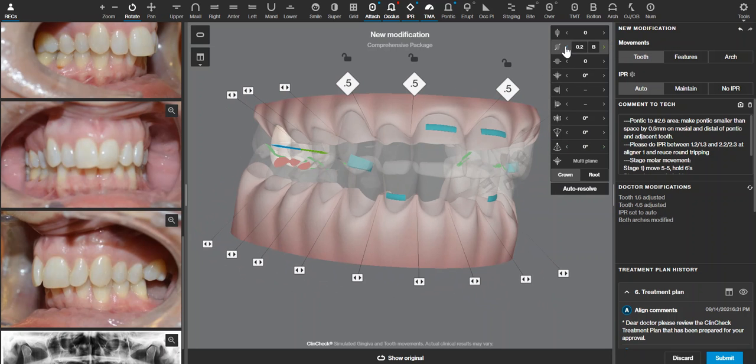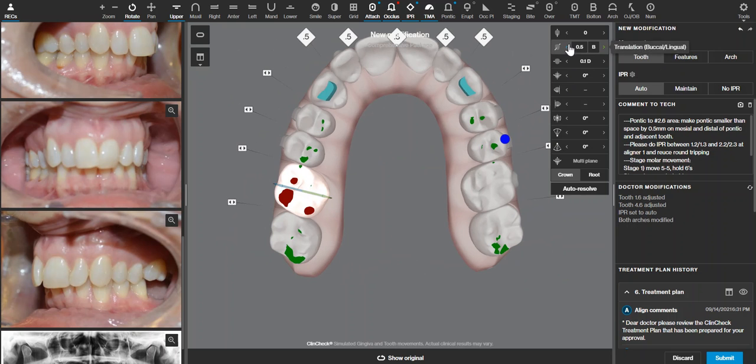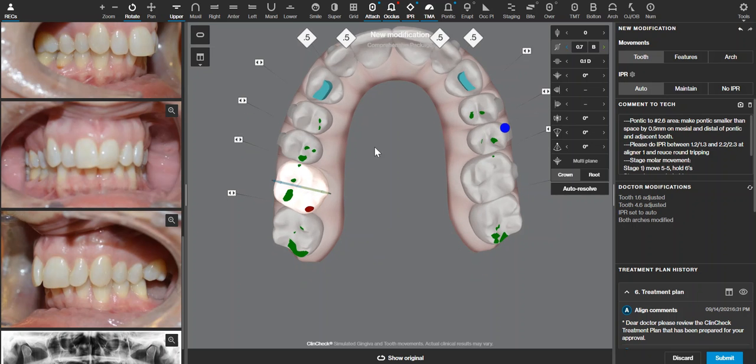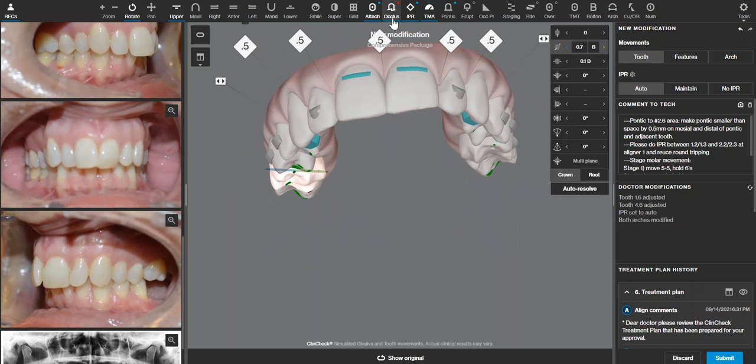I actually don't often add buckle tipping to the molars since I think that's going to happen on its own, and I will just do this until it looks like it's in a good arch position.